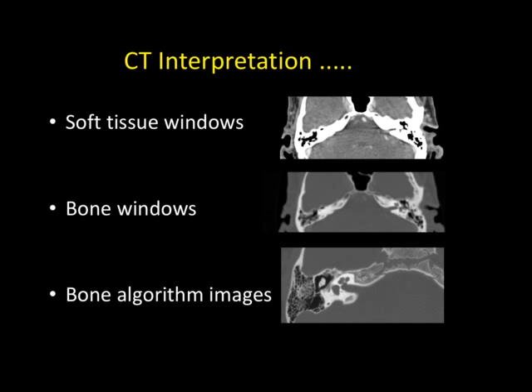bone. Especially, I have seen that I go back in the nasopharynx cases. I go back to the PET CT, open the CT scan, and try to look for subtle clival erosion which is not otherwise picked up on MR. So I do not rely much on the bone involvement in nasopharynx until there is gross marrow invasion. If you're not seeing gross marrow invasion, go back into the PET CT, because PET is usually done within a couple of days' time with the MR. So go back and look for subtle erosion along the clivus, along the sphenoid bone, that you will pick up better on the CT than on the MRI.